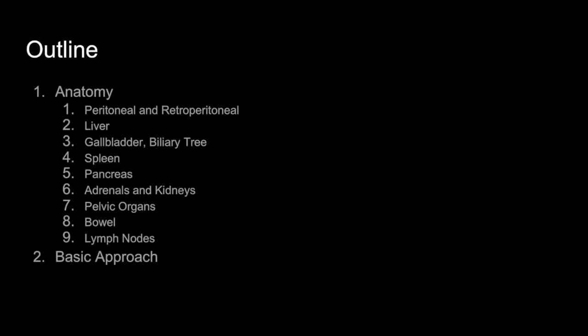In the second video, we'll talk about the things that you'll commonly see, the things that you should never miss, and some clinical pearls that are going to help you deal with common clinical situations. Before we jump into a normal scan and go through basic anatomy, I think it's really important to understand a few basic things about the peritoneal cavity.